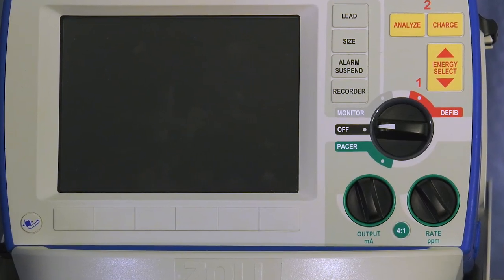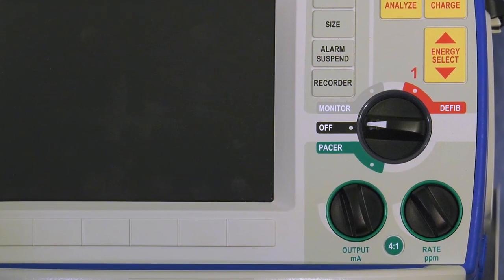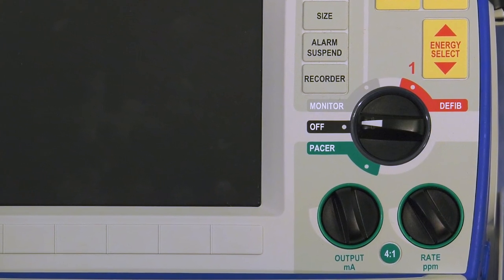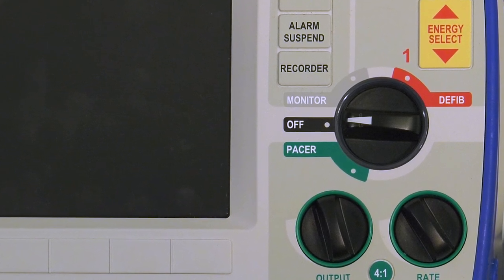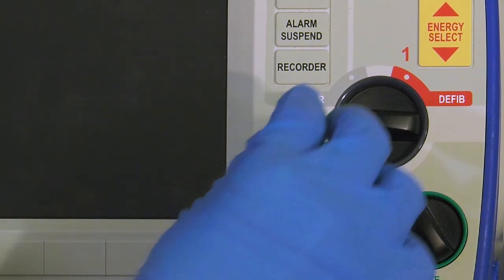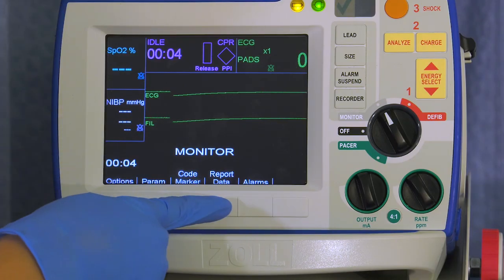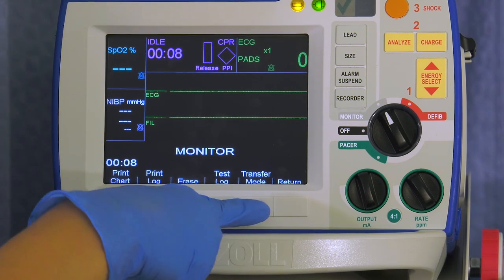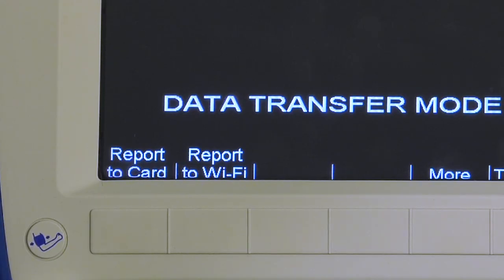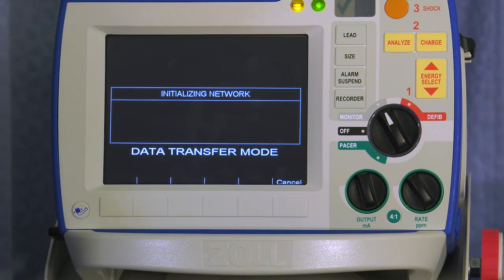The R Series has the ability to transfer data from the defibrillator to an external system, such as a network computer, through Wi-Fi or compact flash card. To transfer data, place the R Series in monitor mode. Press the report data soft key, then press the transfer mode soft key, then press report to card soft key if transferring to a compact flash card, or press report to Wi-Fi soft key if transferring by Wi-Fi.